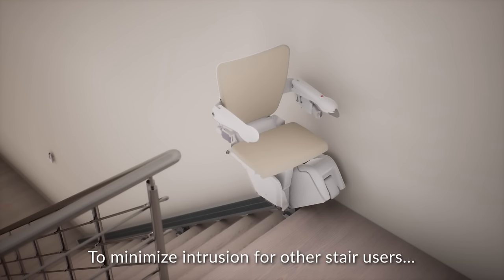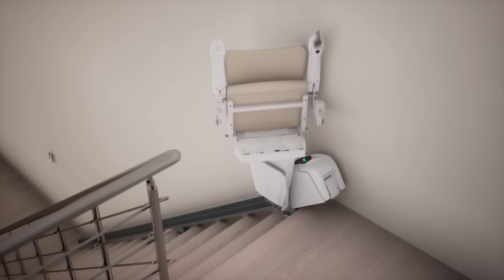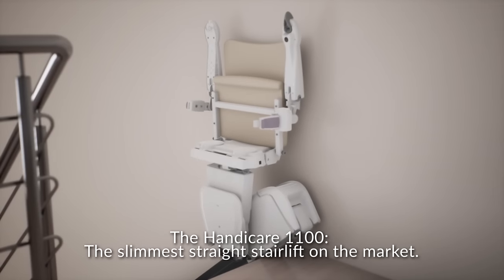To minimize intrusion for other stair users, the stairlift can be folded up. The HandyCare 1100 — the slimmest straight stairlift on the market.